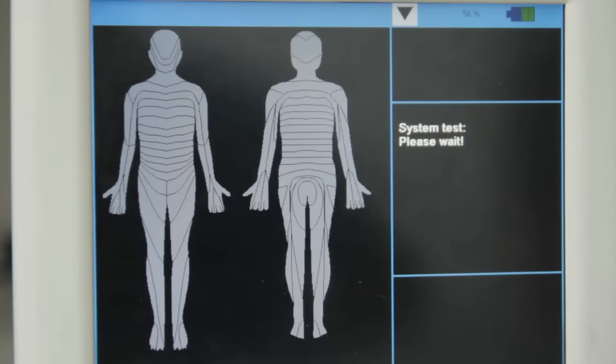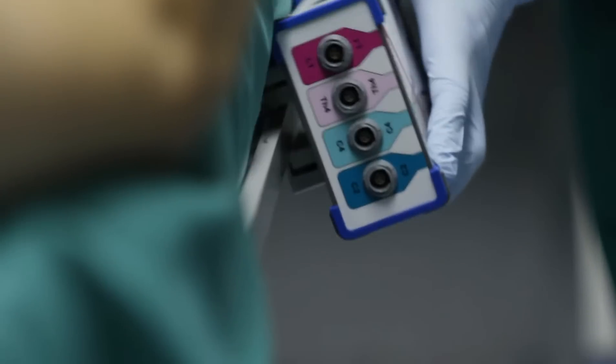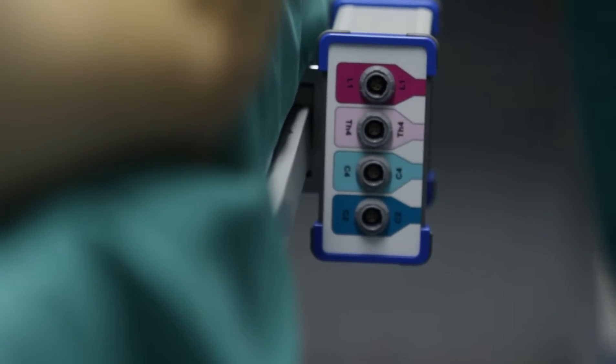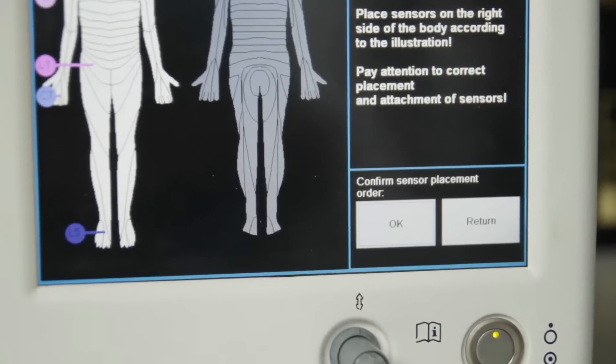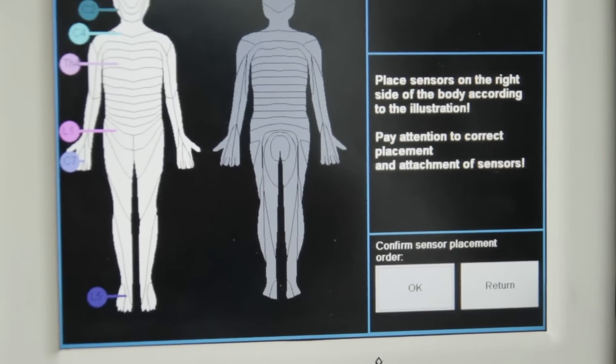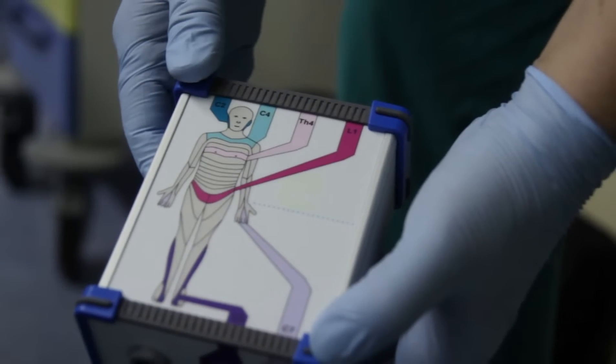First, we turn on the screen. It is important to wait about four minutes after placing the six non-invasive sensors on the patient's dermatomes. It is just as important to place the sensors correctly. Here we see an instruction manual on the screen and also on the sensor box.